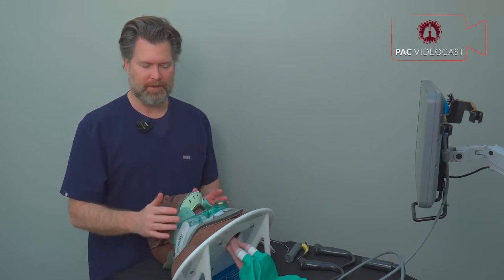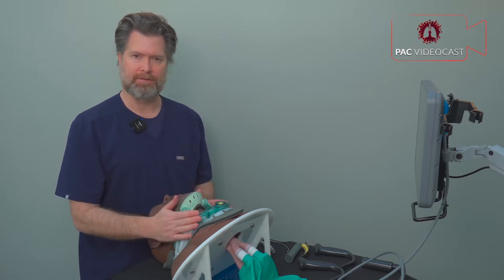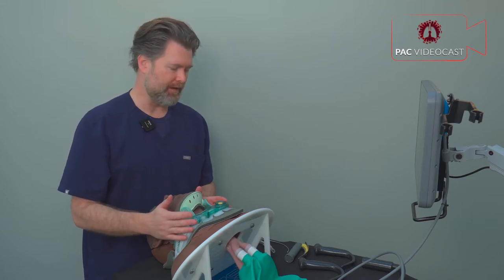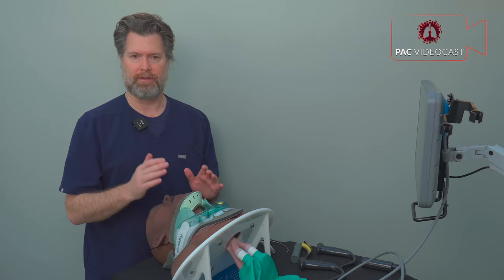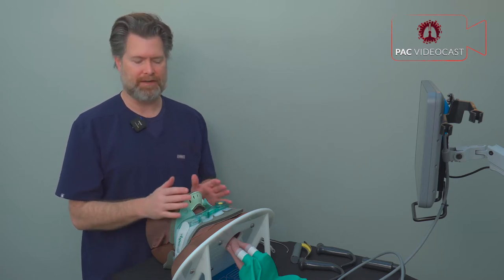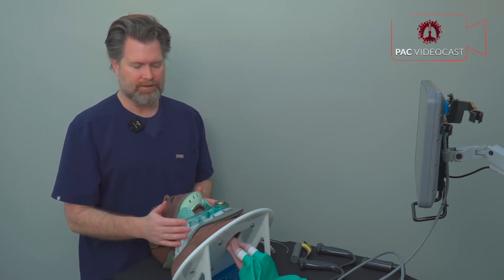In this segment we are going to discuss how to intubate a patient with a suspected cervical spine injury — that means the cervical collar is in place or you're holding manual inline stabilization. We're going to start by looking at all the different options available: the direct laryngoscope, video laryngoscope options including standard geometry blades and hyperangulated blades, bougies, rigid stylets, and regular stylets, to determine what option is best for these patients.